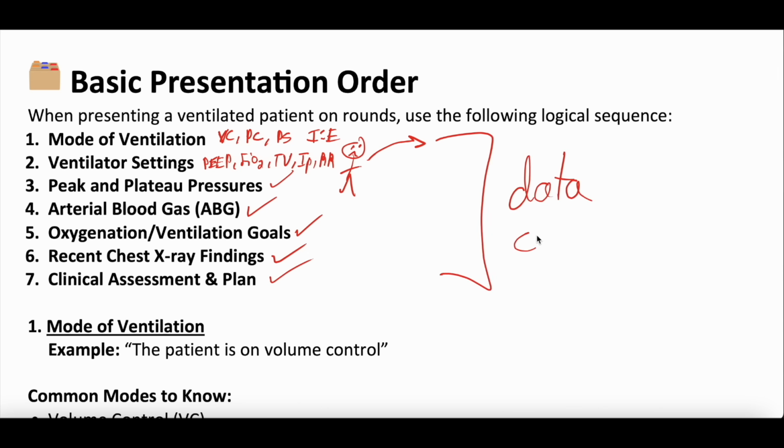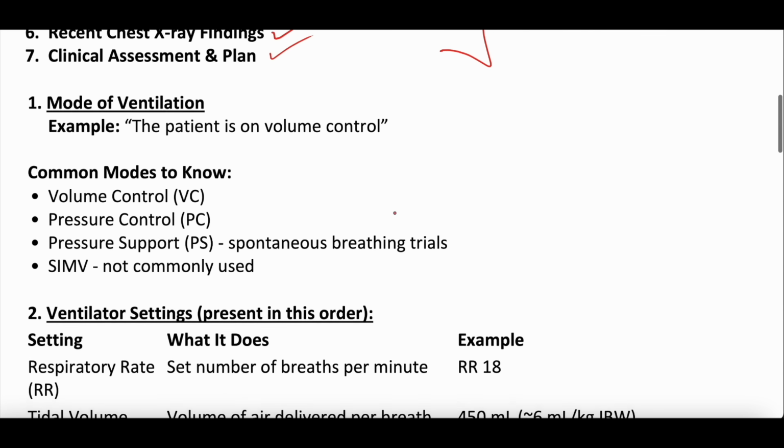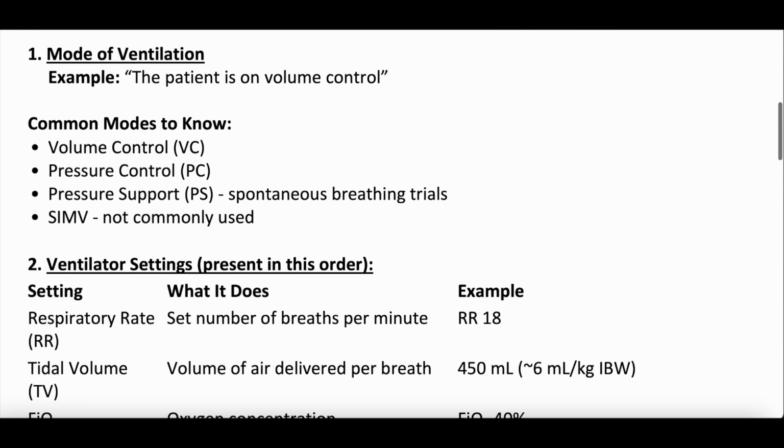These are the things we're going to be talking about in terms of how to collect the data, how to think about it, and how to present it. So if you start with number one, mode of ventilation. The common modes to know, and we've talked about this in the past.